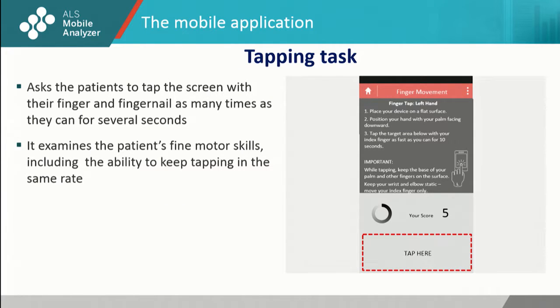The tapping task asks patients to tap the screen with a finger or fingernail as many times as they can for several seconds. It examines patients' fine motor skills, including the ability to keep tapping at the same rate.